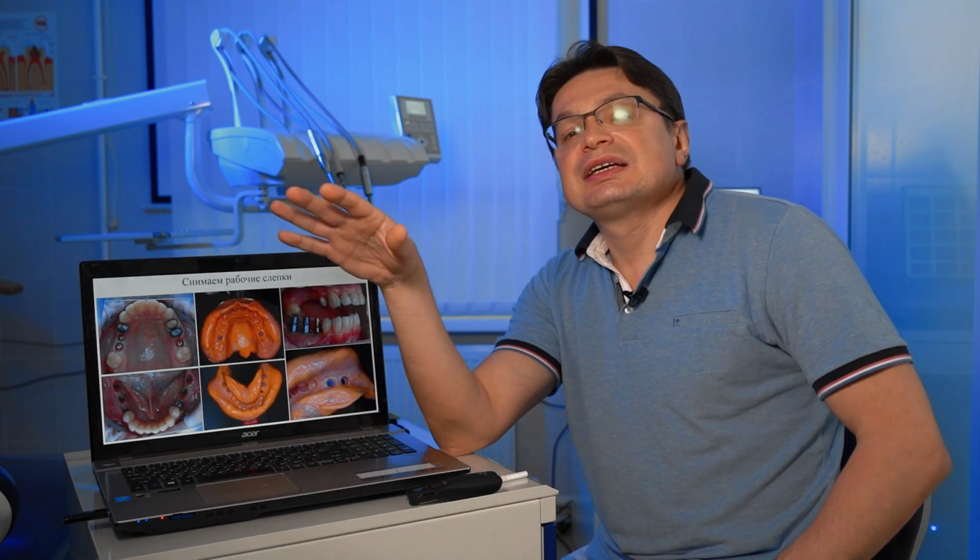And then, after you have registered everything, step by step, everything was documented, you have an improvement, the next step is temporary prosthetics. There are so many nuances here, you need to explain to the technician all the stages. You have another moment in which you start to have contradictions. This is a technical laboratory.